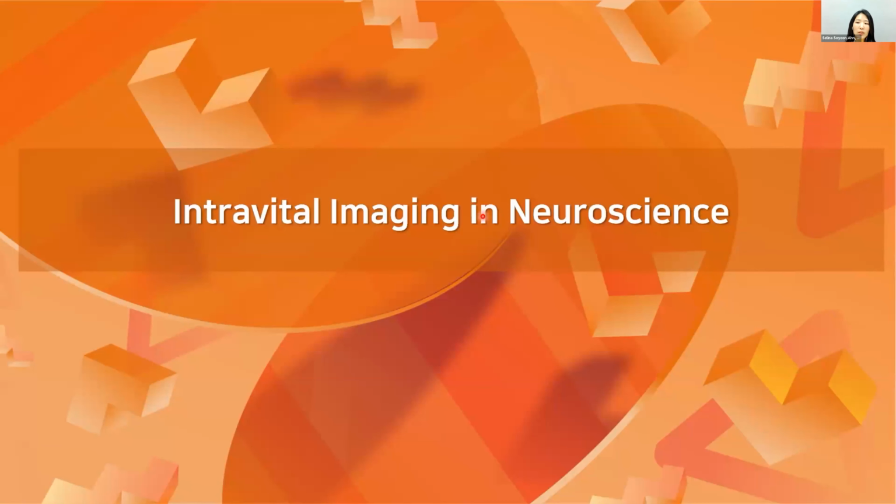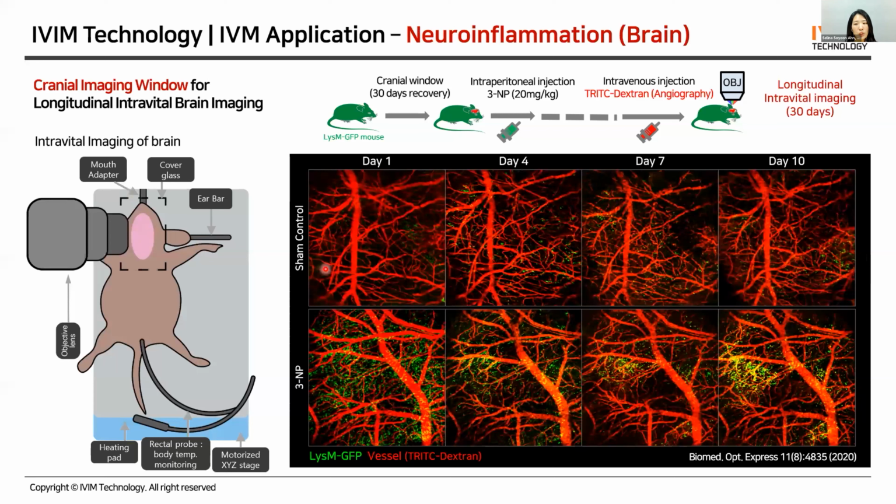The following is intravital microscopy application in neuroscience research. For long-term in vivo monitoring of the mouse brain, we utilize the cranial imaging window to visualize the cerebral cortex. This is a research example monitoring brain neuroinflammatory responses induced by 3-NP chemical injection. After induction, Lysm-positive leukocytes become densely located in a specific site of the cerebral cortex within 10 days after inflammatory induction.